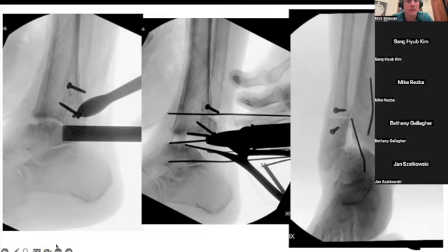So what do you guys use in an Unna boot? One of my buddies who does a lot of total ankles does an Unna boot, a specialized pressurized dressing. How do you guys get that and so forth? Is it well tolerated by the patient? Mostly it seems to be well tolerated by the patient. Some of them complain about the swelling, or the pain from the swelling, but that has been minimal. I can't tell you much more than that, because I just say put an Unna boot on, and the cast techs have the cream and the dressing and the strap, and then I usually put a temporary splint on behind that.